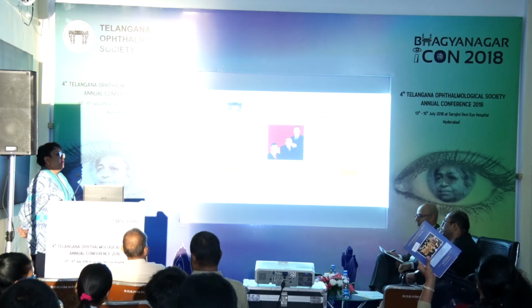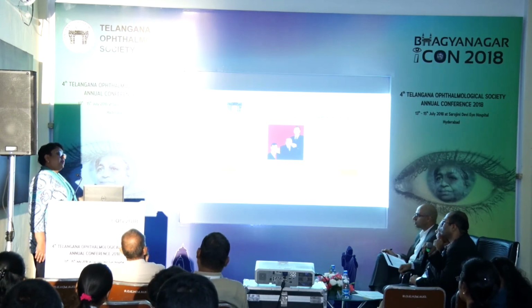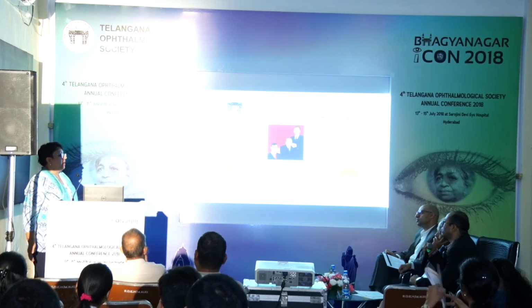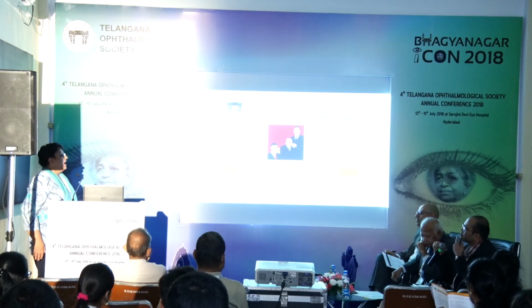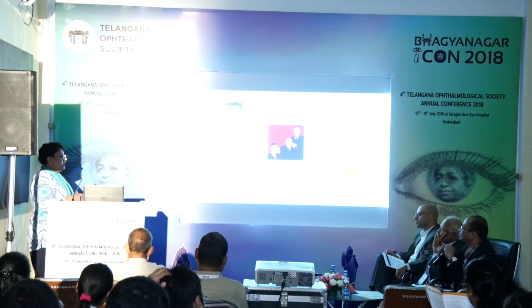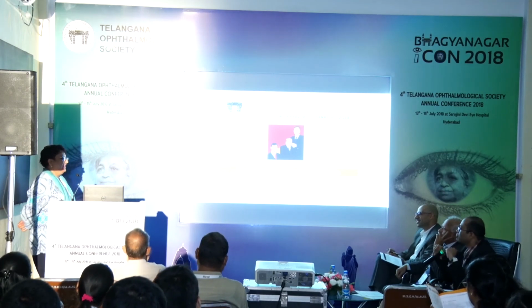Yeah, putting the lens is not a problem. Actually, how it has been explained in the West, that you approach it temporally and do it nasally, is far more difficult. When I suggested that I sit superiorly and ask the patient to look down, they said, "Wow, that's wonderful. Why haven't we thought about that before?" It's so much easier, and you don't have to align. I don't know if you've used a direct gonioscope or not, but you have to ask the patient to look in a particular way. You have to tilt the microscope. Many things you have to do. I had to do nothing.